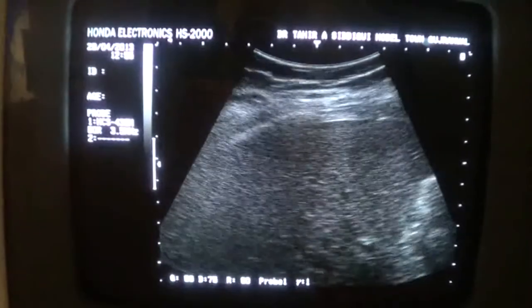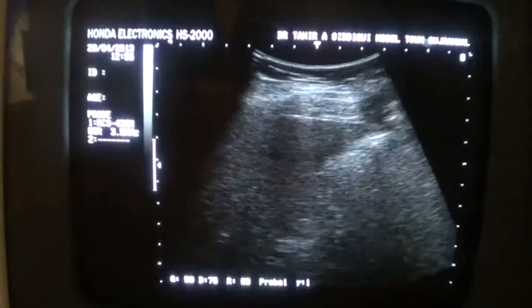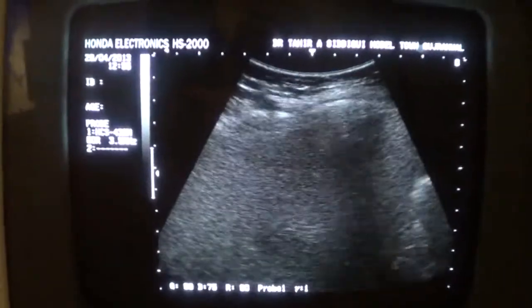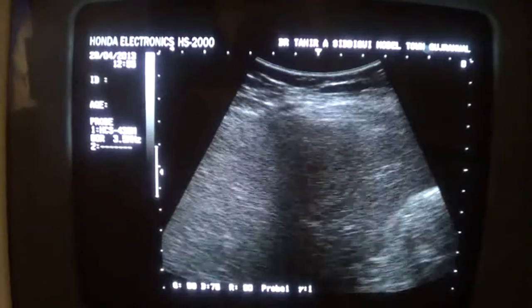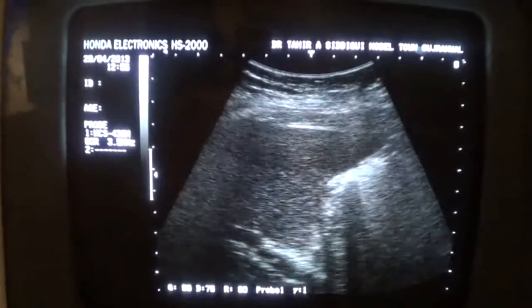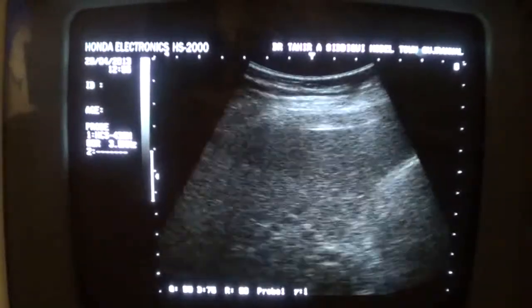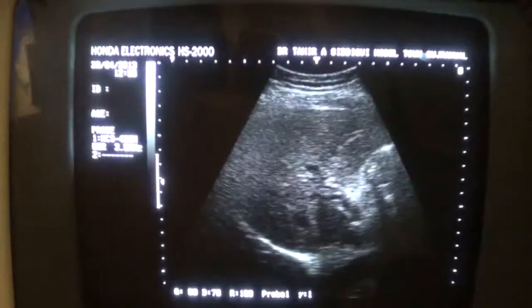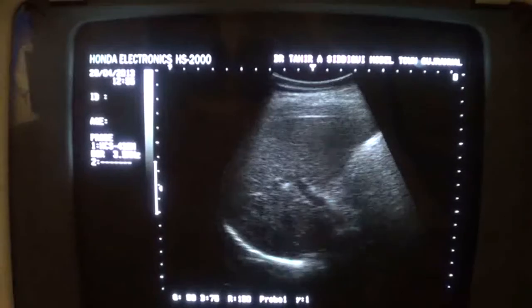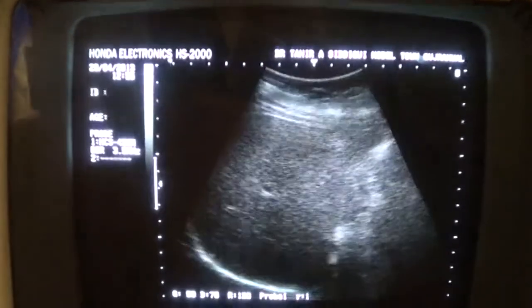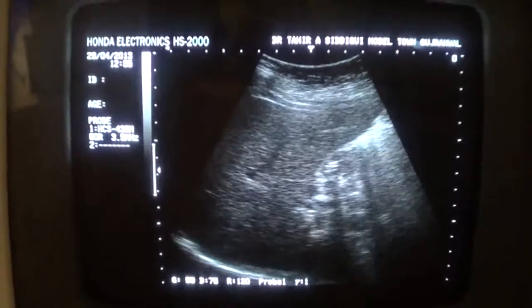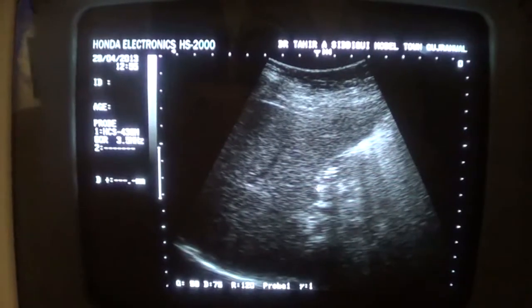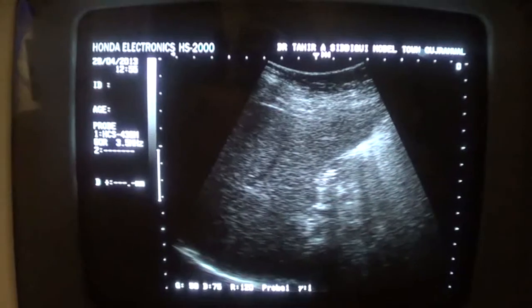With the patient in supine posture, it is the gallbladder. It is really not easy to depict the gallbladder in such a contracted state. Be careful. Now here you can see that only this much of the gallbladder is seen. These are the calculi.